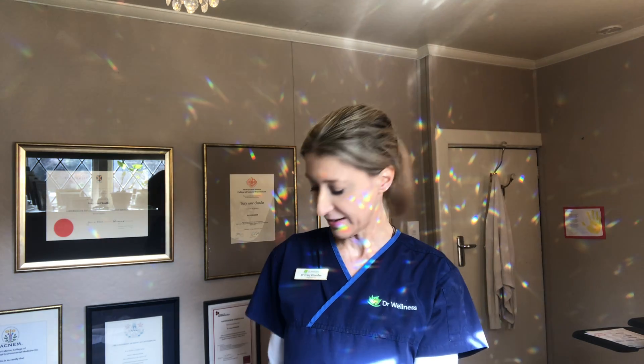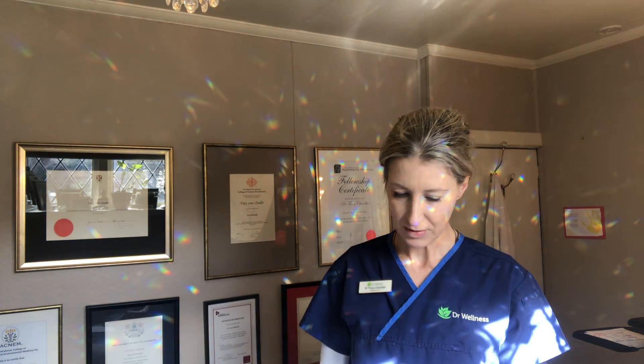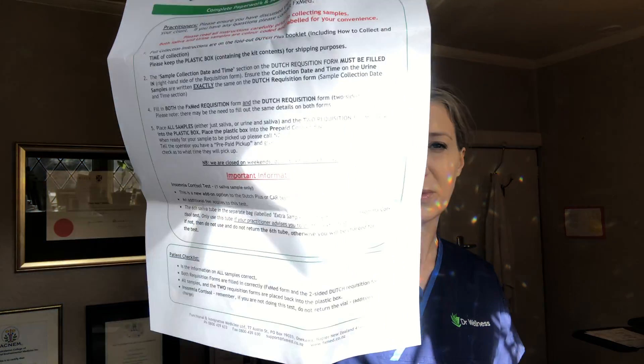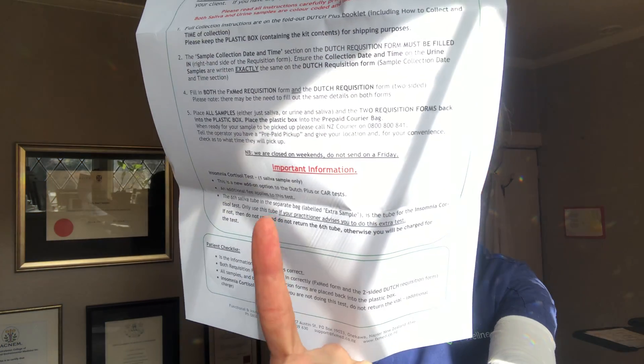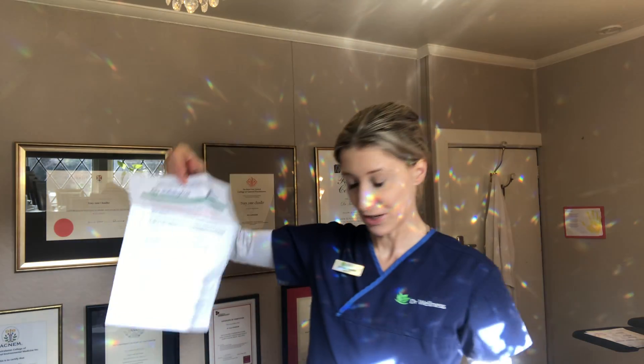Along with the urine and saliva collection devices, you'll also find this piece of paper in your kit. This one is pre-filled for you — you won't need to fill it in. There are also instructions at the bottom for what to do with your kit once you've collected all the samples.